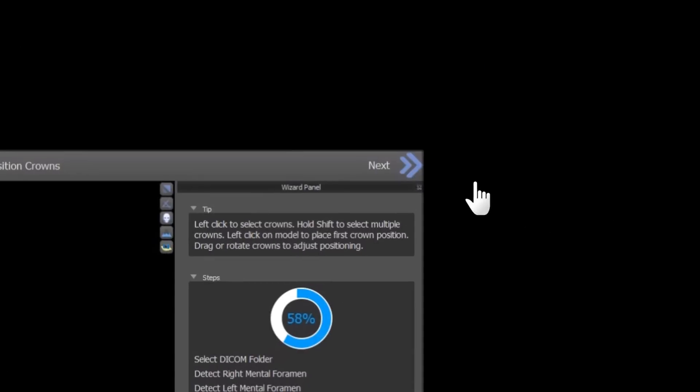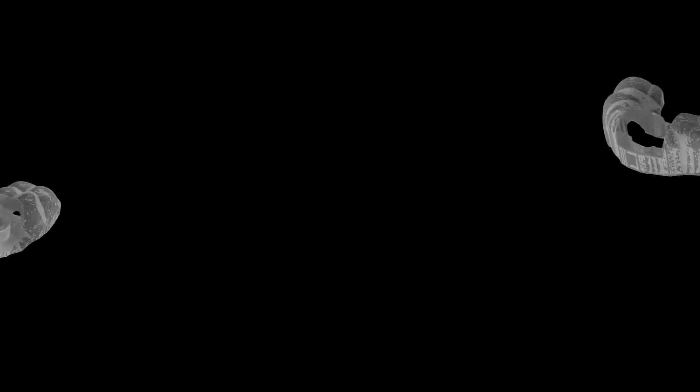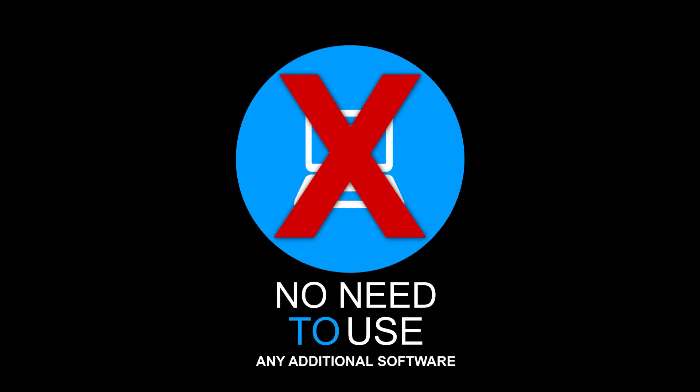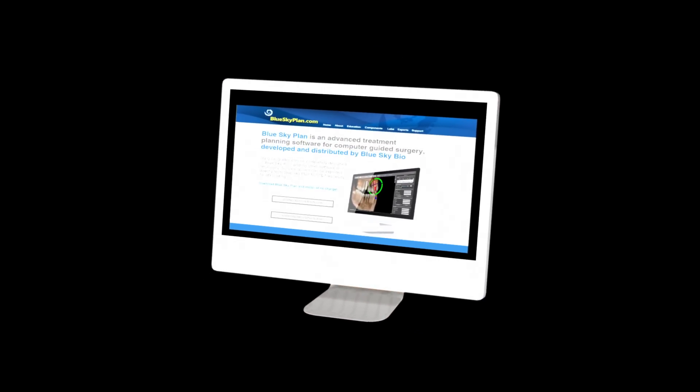Getting started is quick and easy. With a step-by-step wizard, two free surgical guide exports already included, and no need to use any additional software. Go to blueskyplan.com to create your surgical guide today.